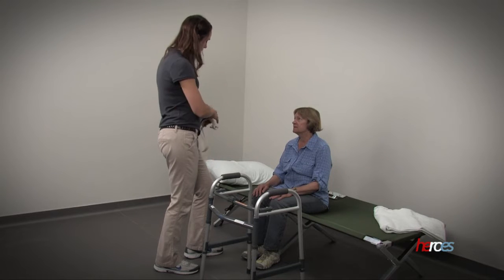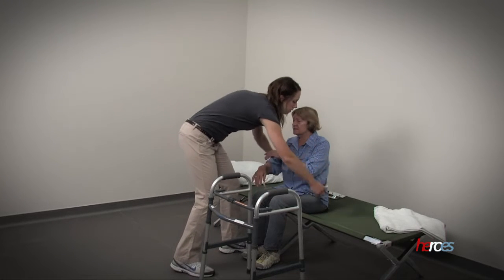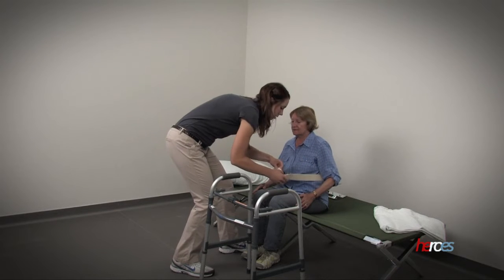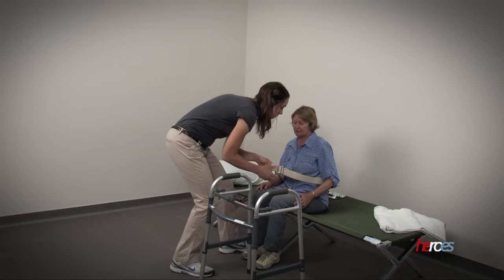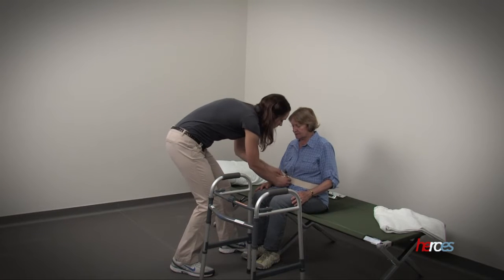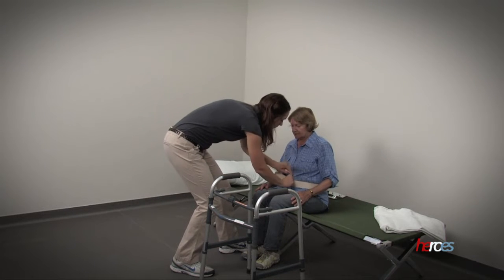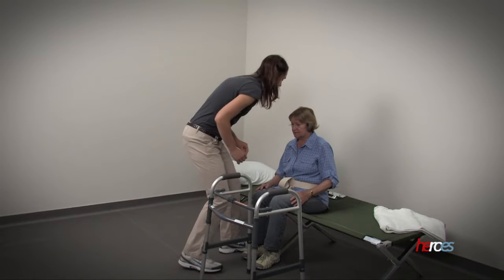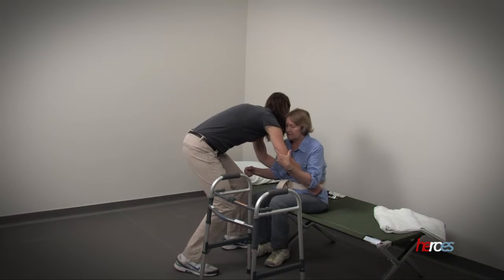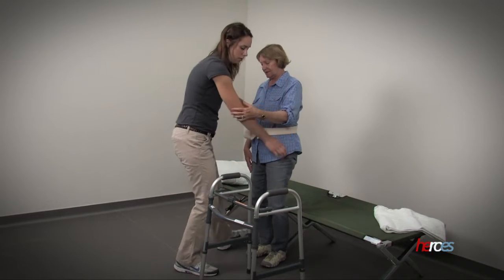Before standing up, fasten a gait belt around the individual for safety. Assist the individual to the standing position and place the walker at a comfortable distance in front of them, as if they were about to use it.